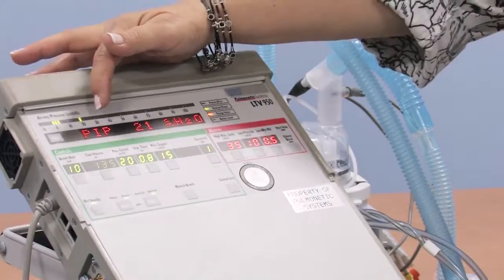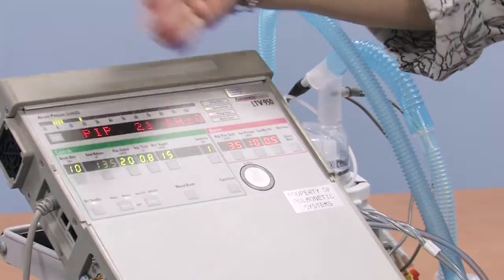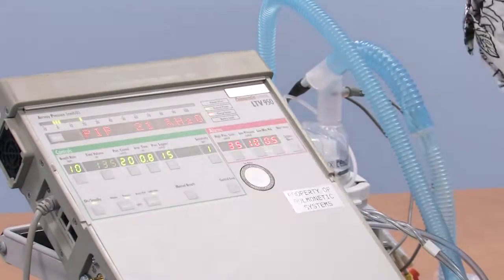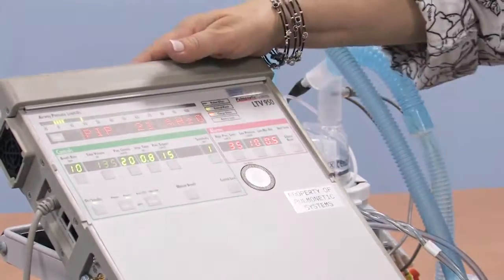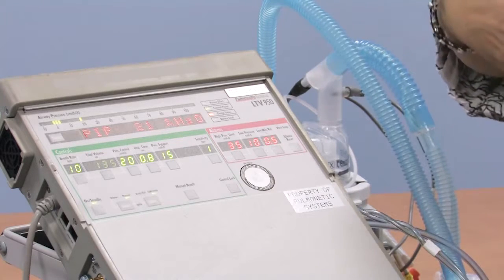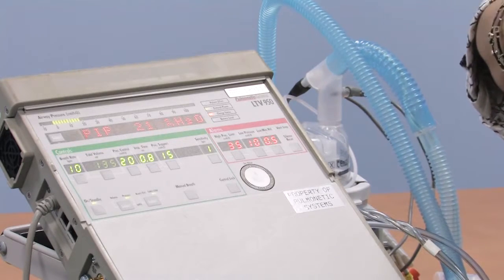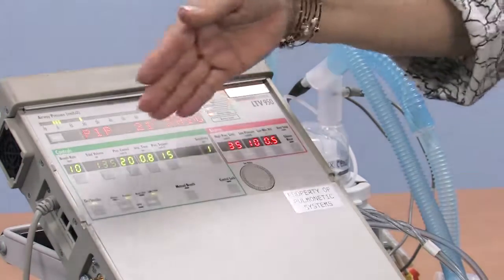So we're looking at numbers here. We see that the pressure is 20 or so and 15 or so, just like it's supposed to be. And it did respond to a cough maneuver that we did to show us that it would go up high and the alarm would stop that breath from pressurizing the lungs over 35 centimeters of water pressure. Those will, again, be numbers that you will discuss with your DME therapist. Doctors don't typically prescribe the alarms, they prescribe the settings.